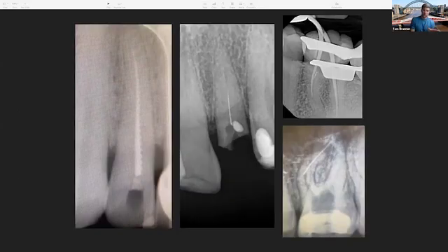Because the first tooth we see, the lateral incisor on the left, this is almost like an entire ProTaper file that's fractured in there. We would hope that it's not bound along its entire length, but this is certainly one that's fractured by torsional failure. It's bound in somewhere along its length. The handpiece is still continued driving, as the lower part hasn't, and it's just untwisted and eventually broken and come off. So I'd imagine it's probably somewhere in the middle to apical part of the tooth where that's happened. I didn't actually end up getting to treat this one because the guy's symptoms settled and he just didn't come back. But that one, you'd want to try and get that out. You can't really leave it, and the chance of bypassing will be quite tricky.